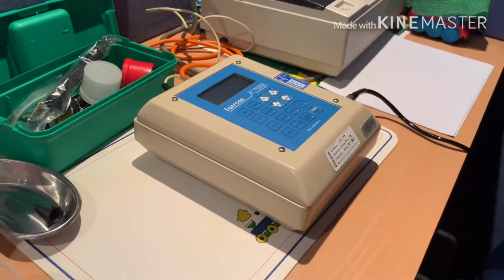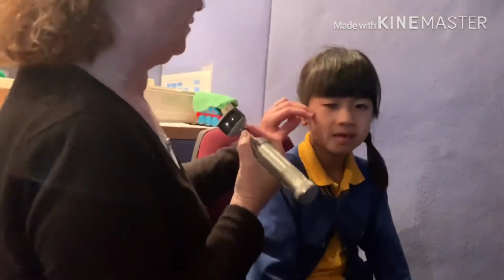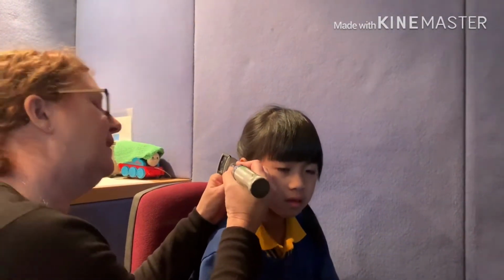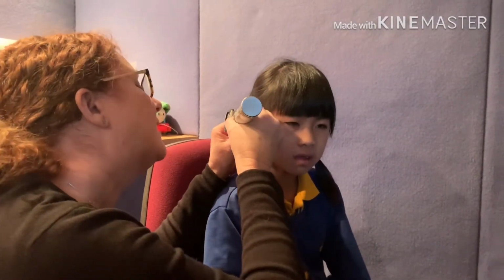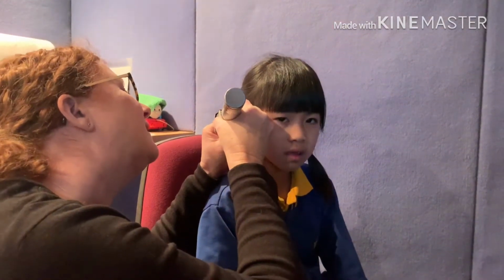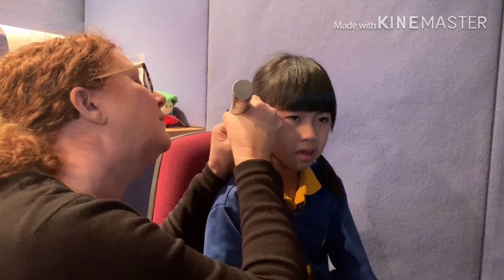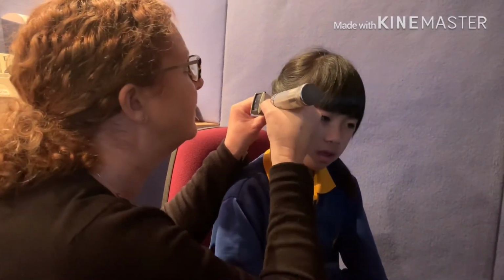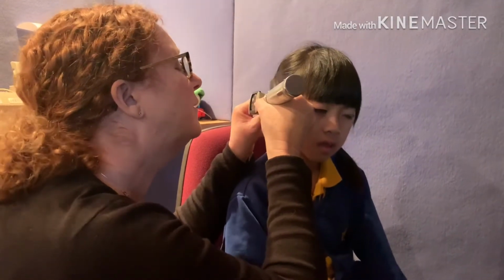You have to point it down the ear canal. The ear canal goes into their head. Very good. So we just have a quick look inside. What we have to do is grab your ear a little bit so that we can straighten the ear canal and see down it, because when you pull the ear, it straightens the ear canal. And then you can maybe see the eardrum. So I'm just looking down the ear canal at the moment, and I can just see the edge of the eardrum. I can't see the whole eardrum.